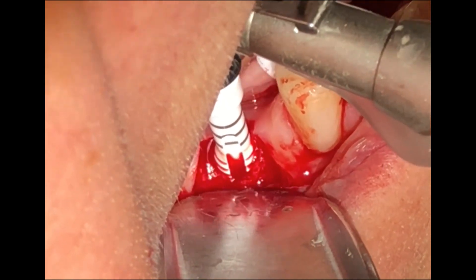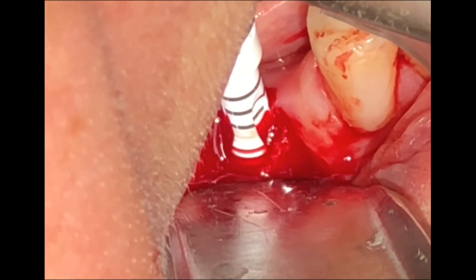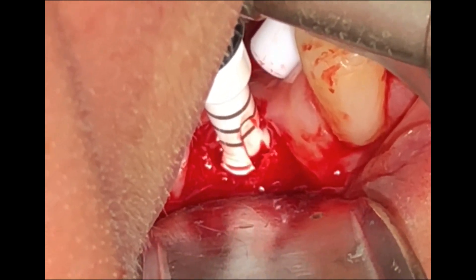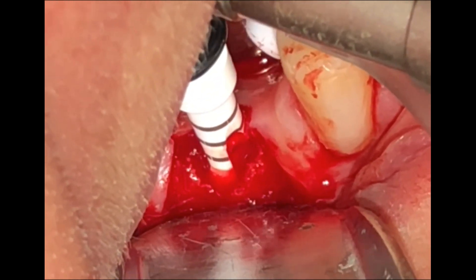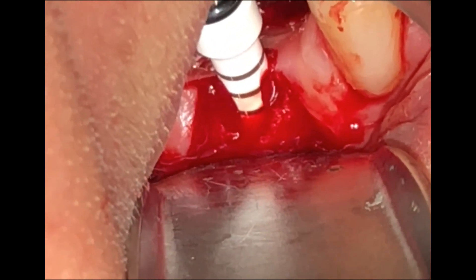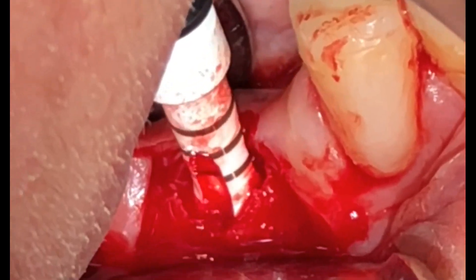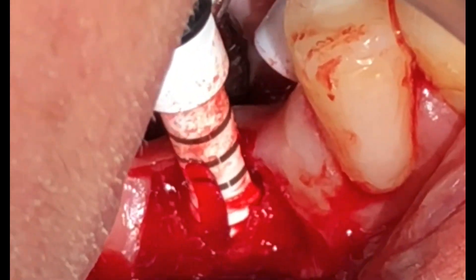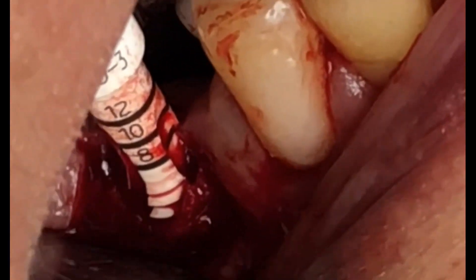The threading drill is used for medium to hard bone — D1 and D2 — and it should go all the way down the entire depth of the osteotomy. Here it is being reversed out of the osteotomy.